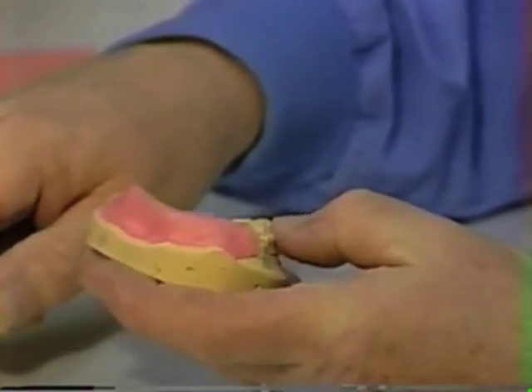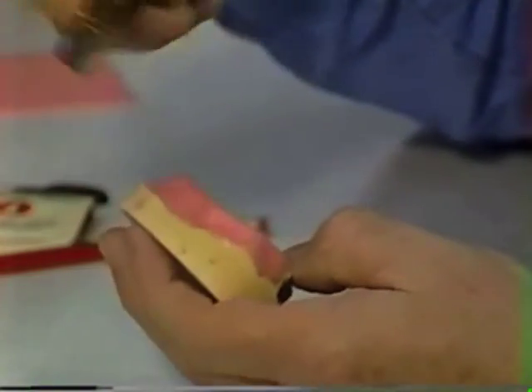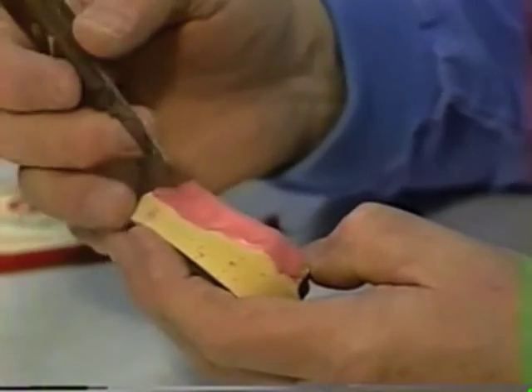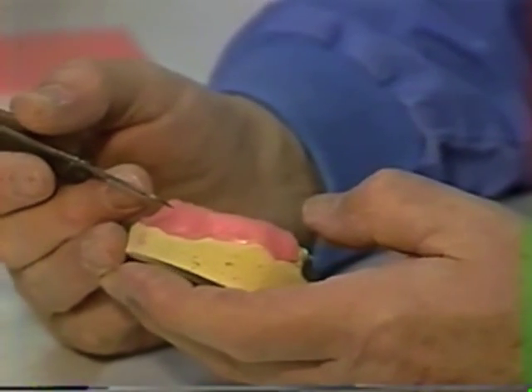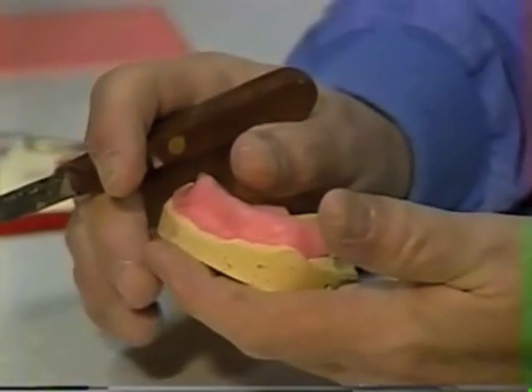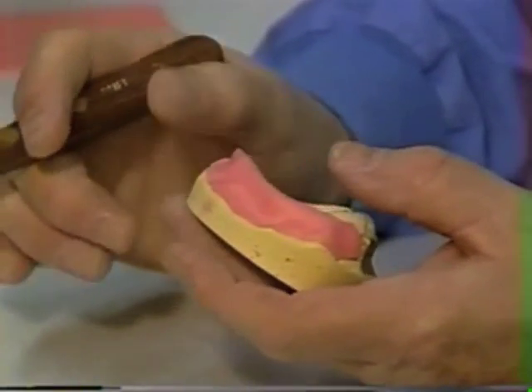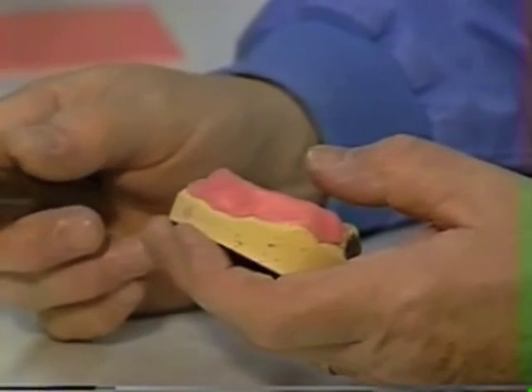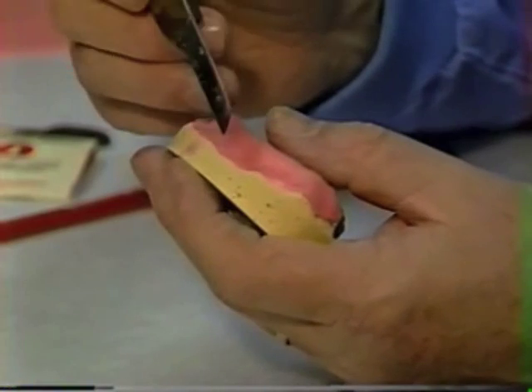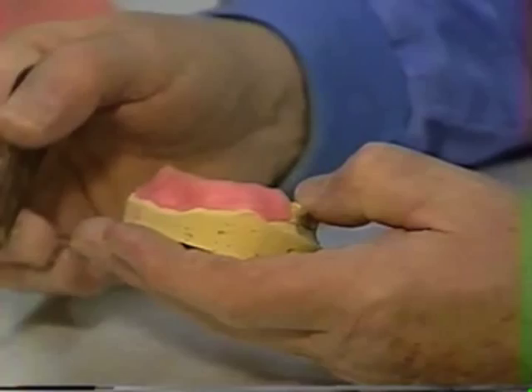We'll be cutting the tray back later to that planned height, but don't cut your wax off to there, and the reason for that is we do not want a lip left on the inside of the tray. We want that tray to be smooth on the inside. In crown and bridge, you're taught to leave a little lip on the inside of the tray, and that's great for crown and bridge prosthodontics, but for complete denture prosthodontics and making a complete denture tray, that lip is detrimental to us because it'll cause a pressure on the ridge that we don't want.